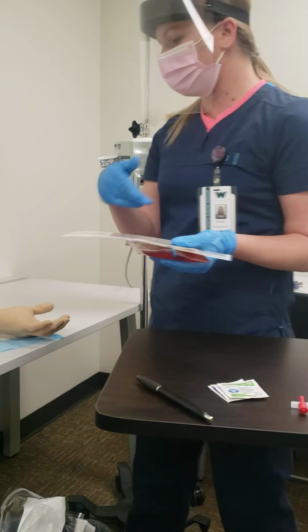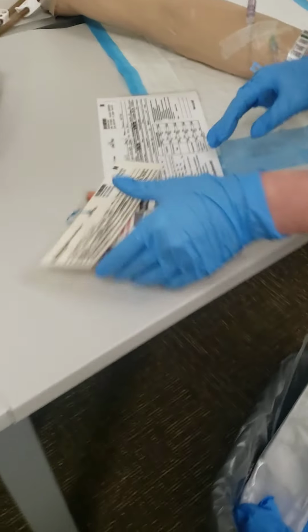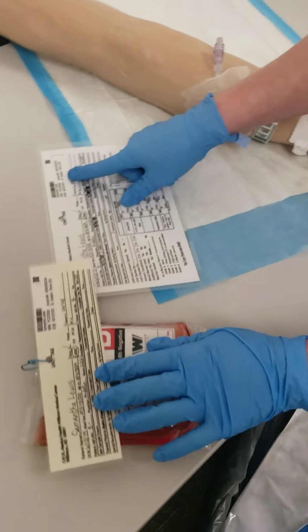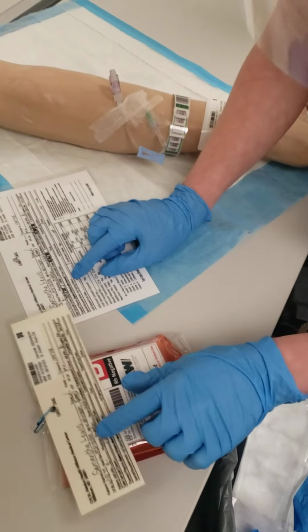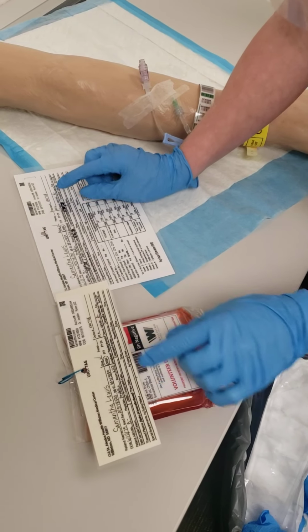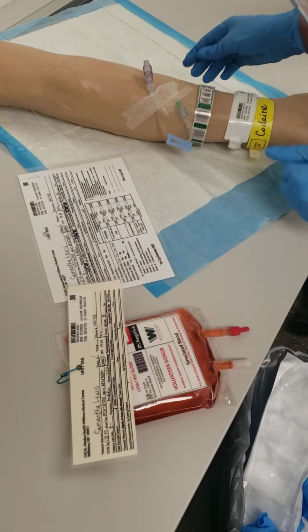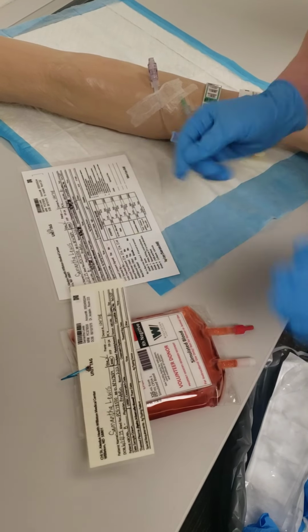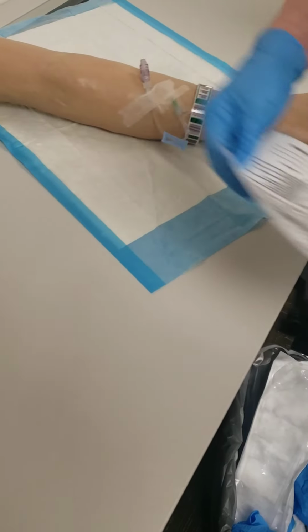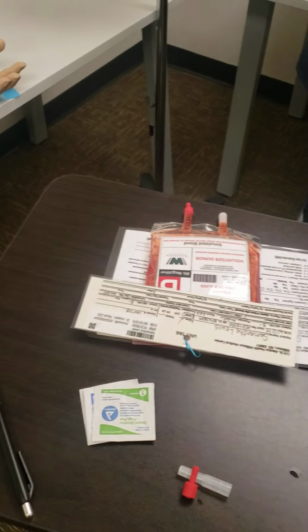Hi, Samantha. Provide privacy, and I'm just going to do a second check with a nurse at the bedside. So once again, we have Samantha Lewis, 6/10/1975, and that matches up with her wristband. Okay, we have the blood bank ID, AFN 3889, donor number 120708, and it's B negative, which also matches up with her wristband. And so can the nurse just verify that for me? Yep. Okay, great. Okay, and so now I will go ahead and start with the administration of the blood.